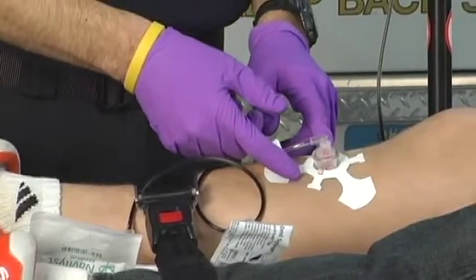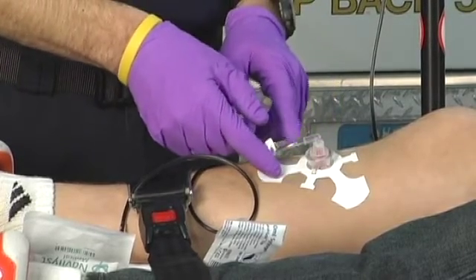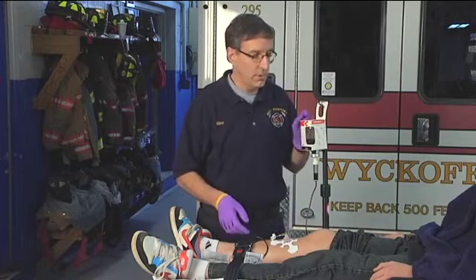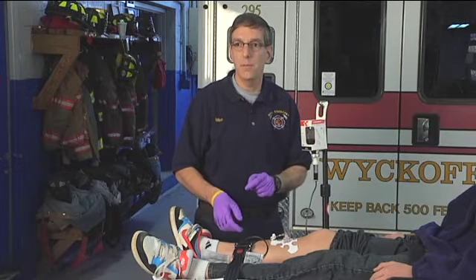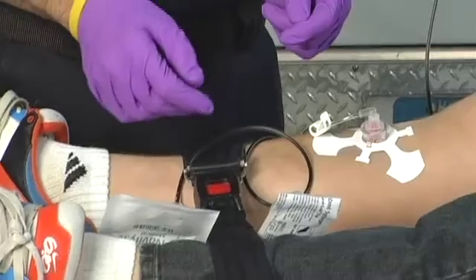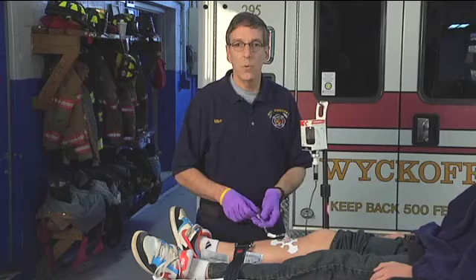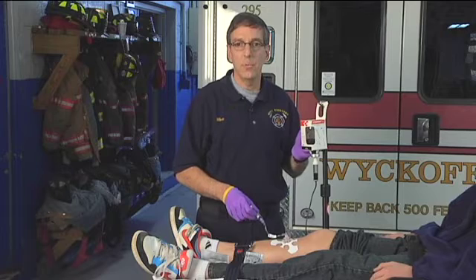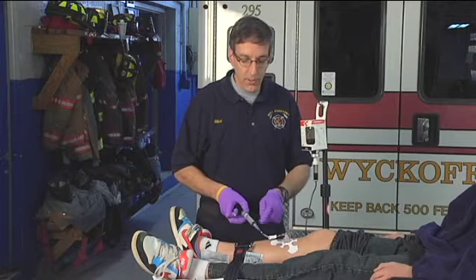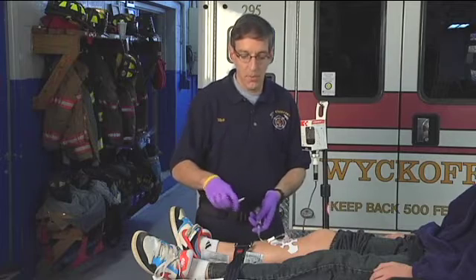We have an intraosseous line in the patient. Many patients during resuscitation will end up with a 15-gauge intraosseous line, which is why we need a stopcock for this setup. To get this medication to run into the patient in seven and a half minutes, we'll have to manually syringe some of it in ourselves. Connecting this directly to the glass bottle won't allow us to squeeze it to increase flow. We've already flushed the IO line with a power flush of 10 cc's to clear debris inside the bone cavity.